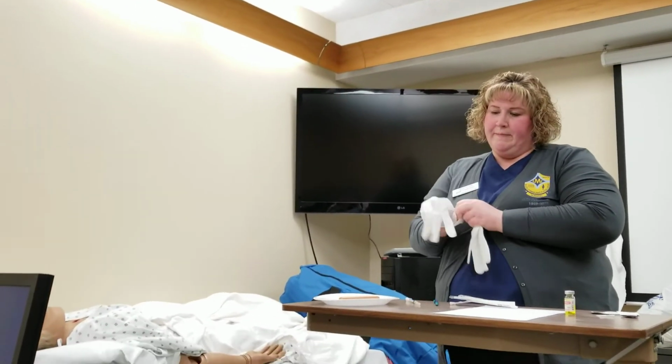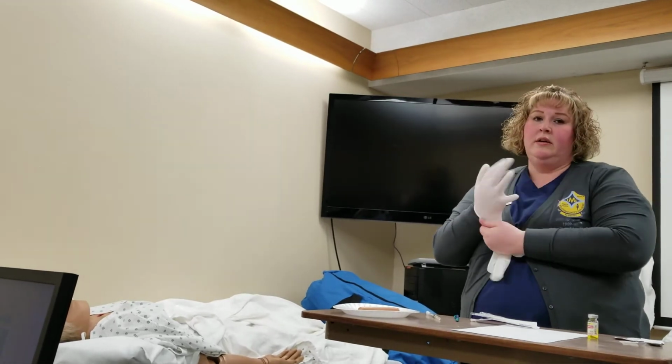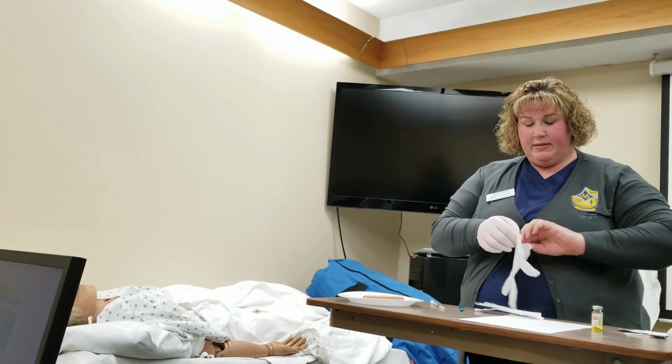So when I go to my patient, I am going to verify that I have the correct patient with 2 identifiers. I am going to put on clean gloves, and I am going to check my 6 rights of medication one more time. That is the 3rd check.